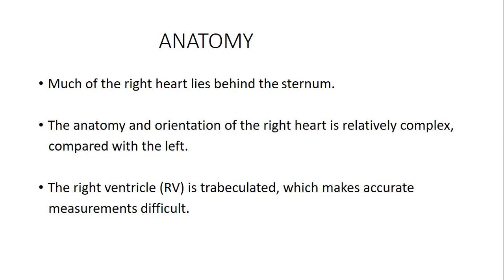You can proceed. Okay. So you also realize that traditionally we don't pay much attention to the right side of the heart, and the reasons could be related to some few anatomical reasons. One of them is that the right side of the heart, particularly the right ventricle, lies just behind the sternum, and this makes it sometimes so difficult to image with ultrasound.